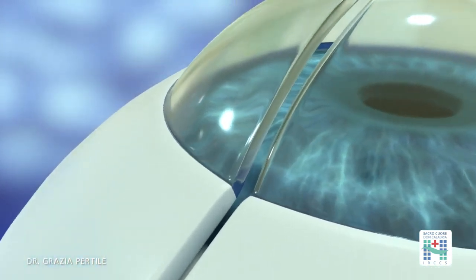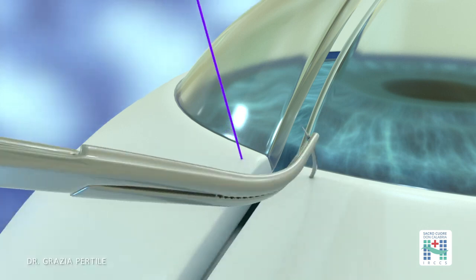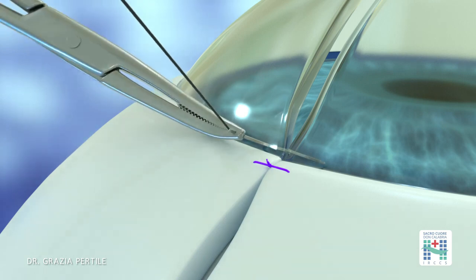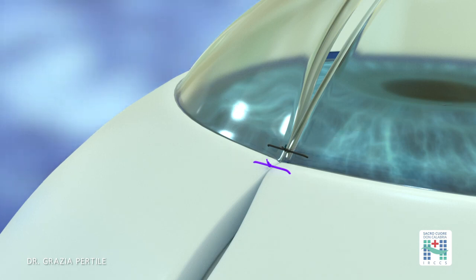As a first step, it is important to re-establish a clear separation between the cornea and the sclera by placing an absorbable suture on the scleral side of the limbus and a nylon suture on the corneal side. The sutures close to the limbus can be tightly secured because they help bring the wound edges closer together without inducing astigmatism.